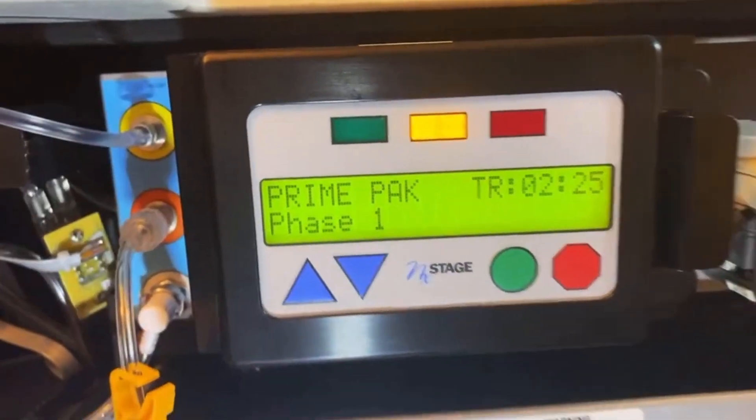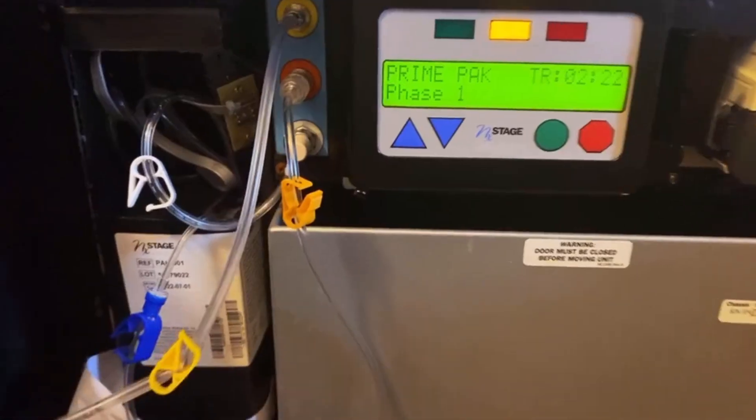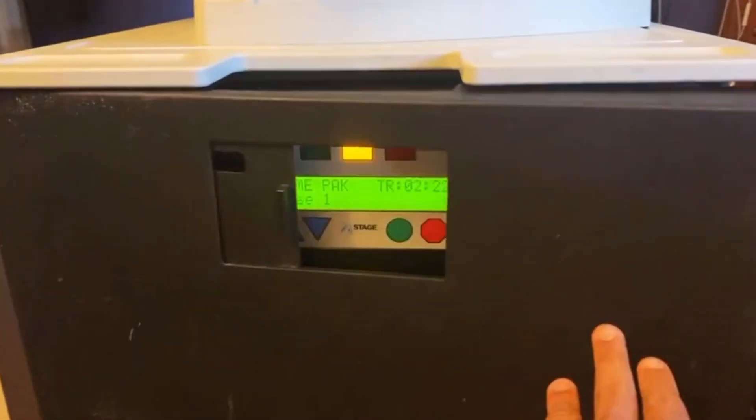To start a new pack, this is how you prime a pack with the NxStage Pure Flow dialysis machine.